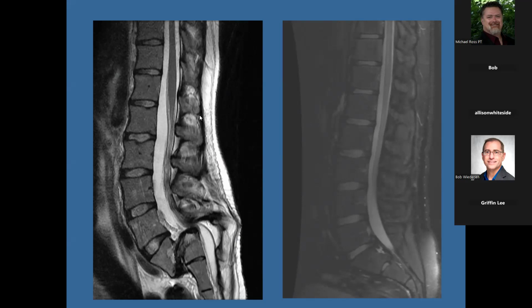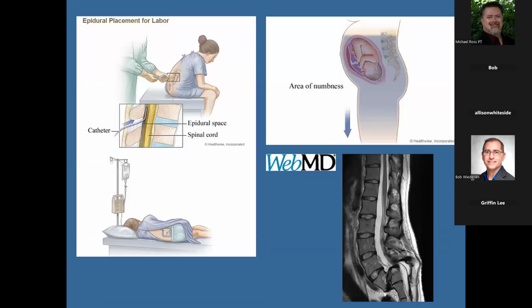And if you look back here, the nerve roots are kind of tethered back there, and you've got hard compression between the posterior elements of L5 and the sacrum. So those nerve roots are being compressed. How does she not have cauda equina? And so the question comes up, what do you do about this? That needle is going to probably go through about L1, L2. That's going to provide essentially anesthesia from the belly button up, a little higher above the belly button down, so that they can have moderate pain relief during delivery.